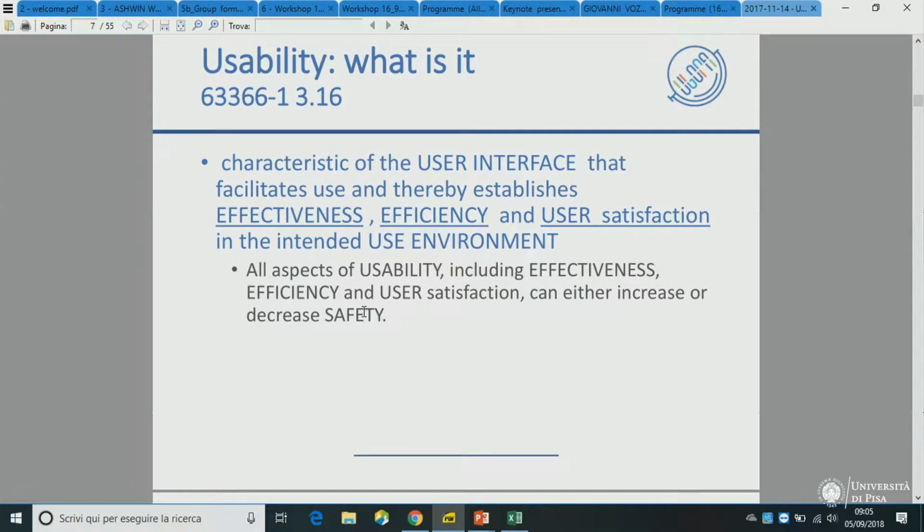There are many techniques to understand if the device is efficient time-wise. You can count the use errors, you can count the use uncertainties, you can calculate how many milliseconds the user needs for each task, and it's very interesting. Think about an external defibrillator, one of those in the emergency. Those devices have times they really need because they are charging the battery before the discharge. And the users have that time to get ready, but if they're slower than that, you're wasting time, right? You're wasting time because the device is ready, but the user is not ready to defibrillate.